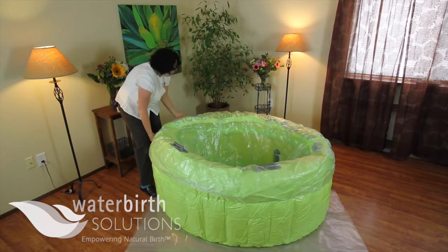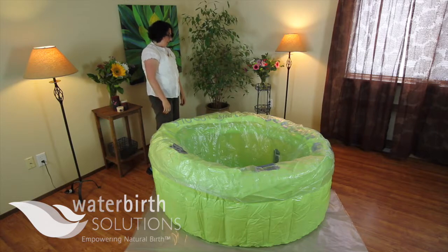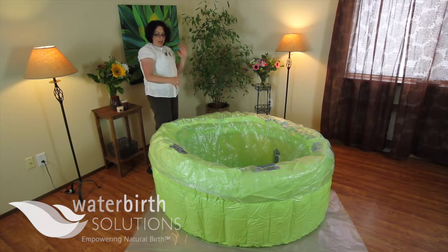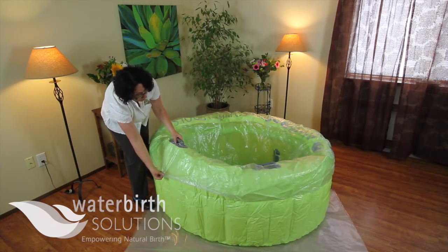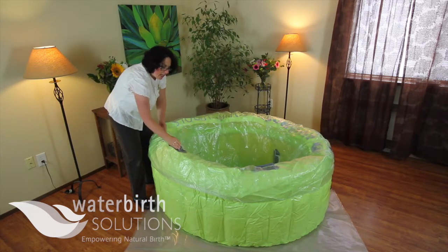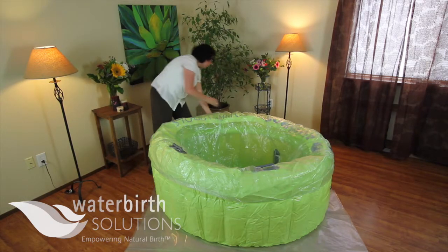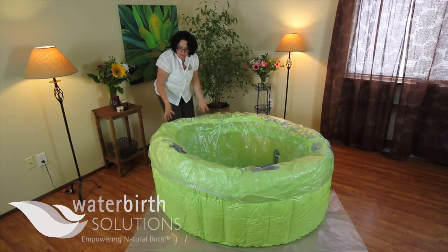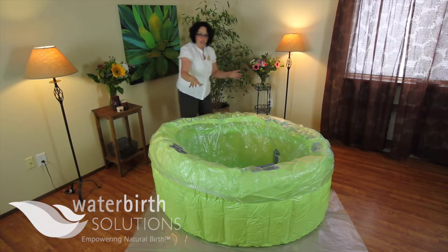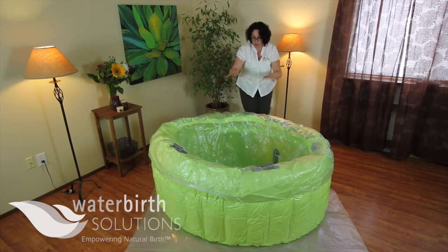All four of the handles are visible. Your liner is going to appear that it's not exactly symmetrical; however, the handles on one side of your pool are at the top and the handles on the other side are more towards the bottom. So the liner itself will fit exactly snug around the pool — it's the location of the handles that's really going to help you locate and situate your liner.